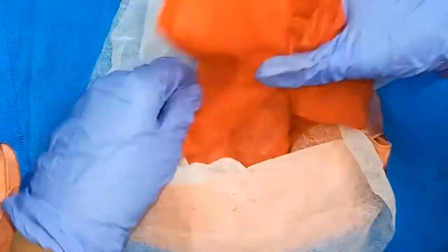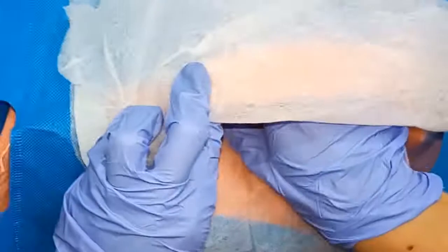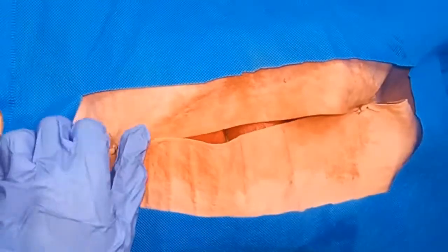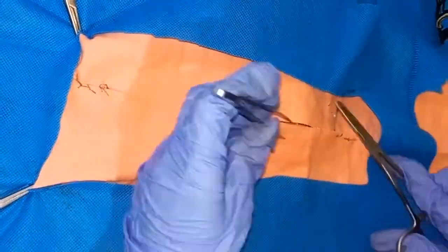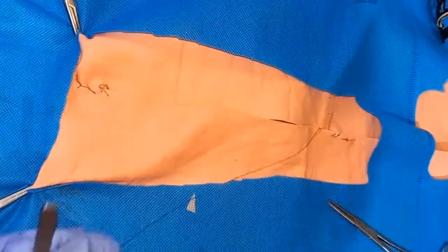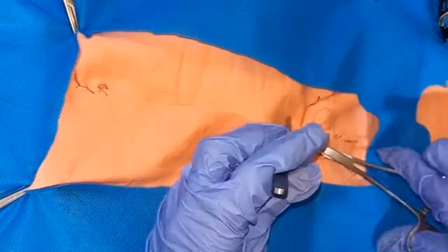Lavage the abdominal cavity with warm physiologic saline solution and aspirate all lavage fluid if contamination or spillage of uterine contents occurred. Non-absorbable suture materials such as polypropylene, nylon, or stainless steel wire may also be used to close the linea alba. The subcutaneous tissue is closed with 3-0 or 2-0 absorbable suture and the skin is closed with non-absorbable suture.